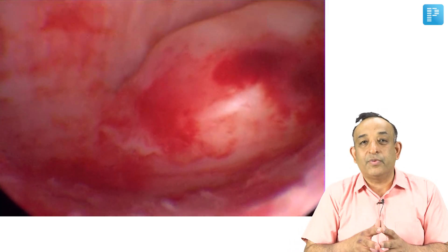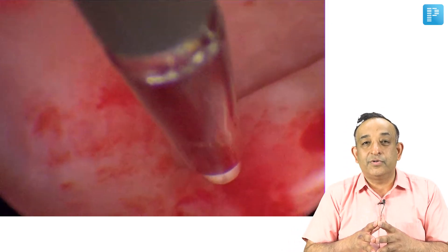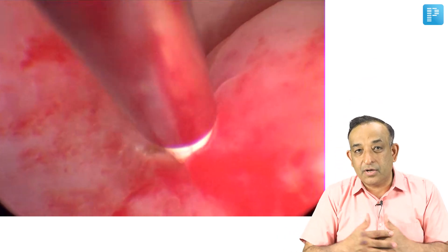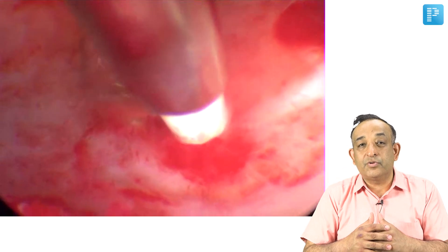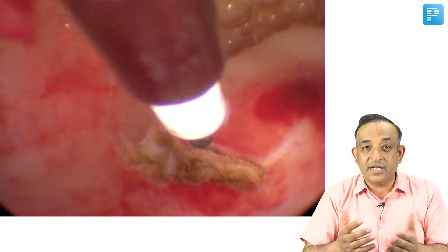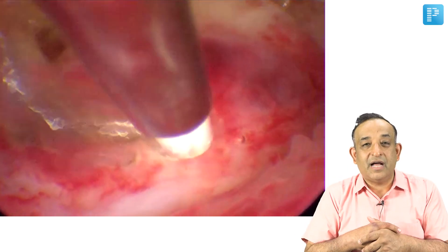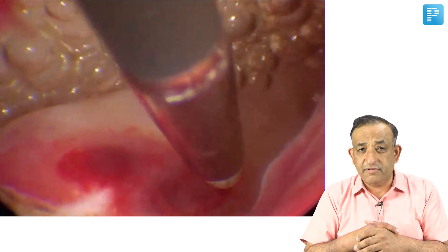I am showing you this video where I have just gone into the uterus and I am using an instrument known as a Versa point. Versa point is a bipolar cautery, and in this I am using a medium of saline to distend the uterine cavity. Now I am cutting the fibroid from its base with a slicing action of the Versa point instrument.